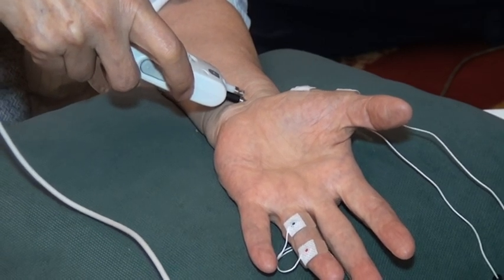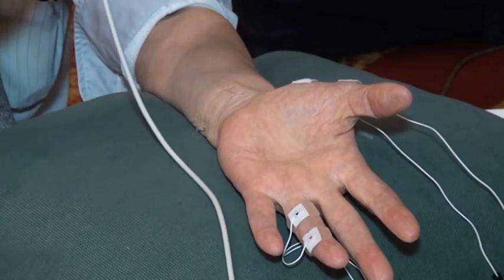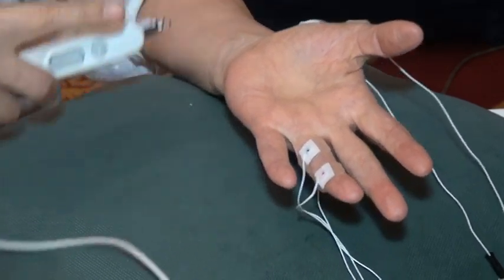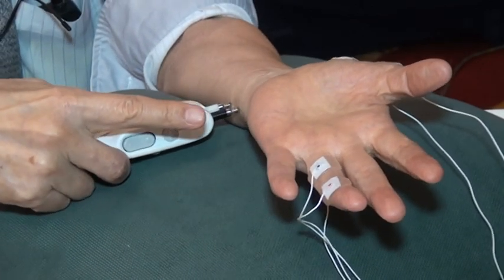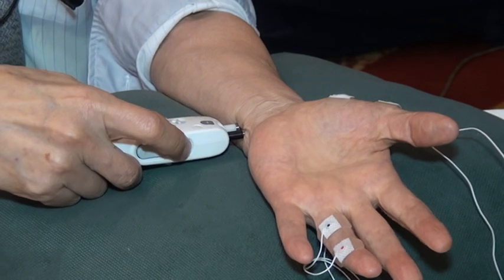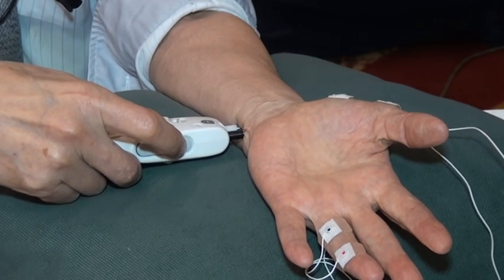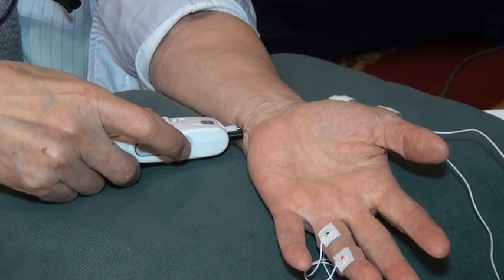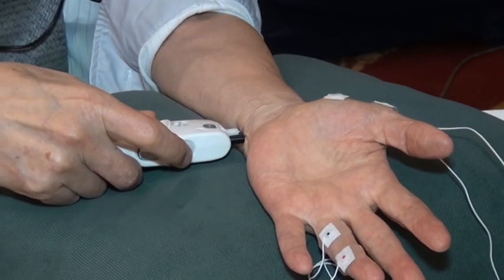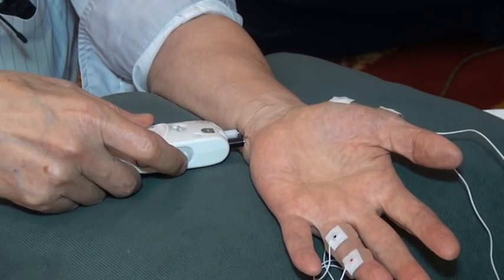I'm stimulating the median nerve, and the waveform is over there on the left-hand side. Now store that. And now I'm going to stimulate the ulnar nerve here, and you watch the muscle. That's a different muscle twitch. What is this twitch? This is adduction, obviously, because I'm stimulating the ulnar nerve.